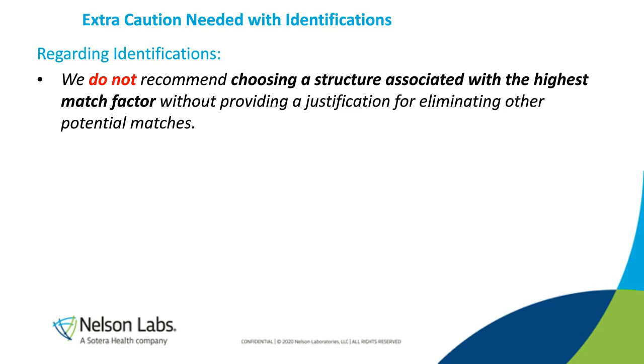And then finally, you can do even a little bit more than that, and that's where not only are there these auto identifications with public and private databases, but there's also more of a manual identification element, where a materials expert will take in the context of the entire device. So they'll say, okay, here's what the databases say, that's how good they match, and I know that this is a specific rubber that we've seen 10 times before, and that informs me in saying that these are what the compounds are. So that's probably the best that can happen in terms of quality.